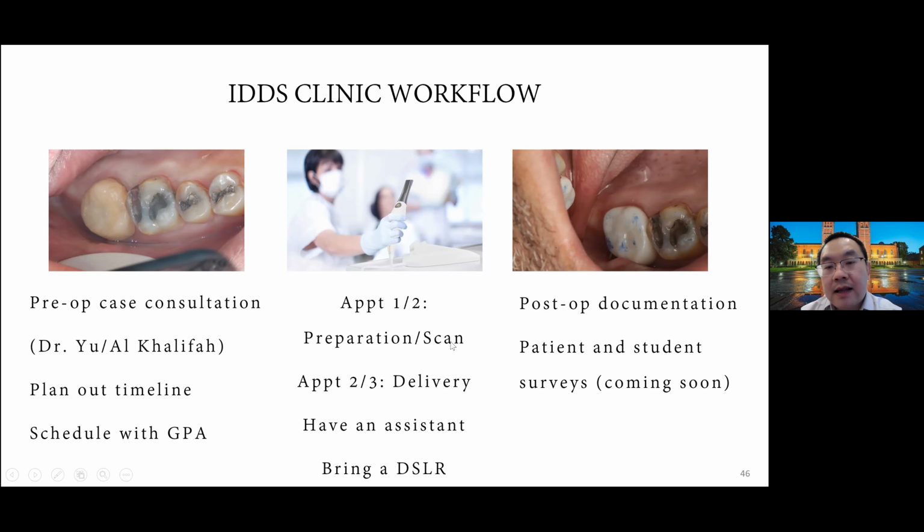Let me talk you through the workflow a little bit, and we're going to show you the cases too. Once you have sat the patient down and numbed the patient, you're going to take a pre-op scan, which gets an overall contour of the teeth scanned in, so you don't have to worry about scanning after the patient is already tired from the preparation. After the preparation, you only have to focus on one thing: the tooth that you prepared. For your final impression, only focus on one tooth, and that's a lot easier.